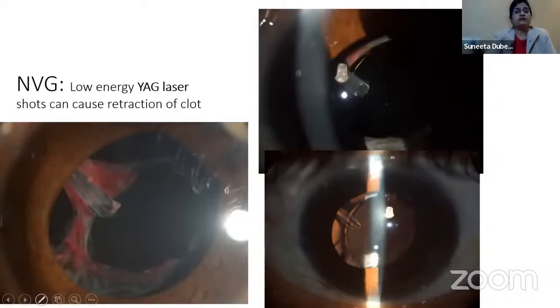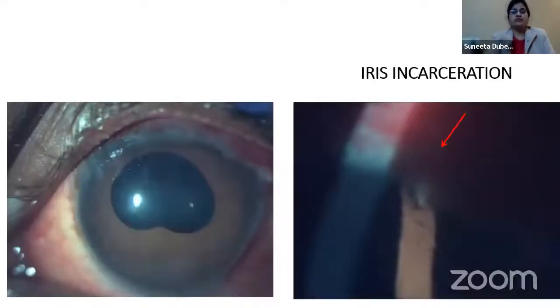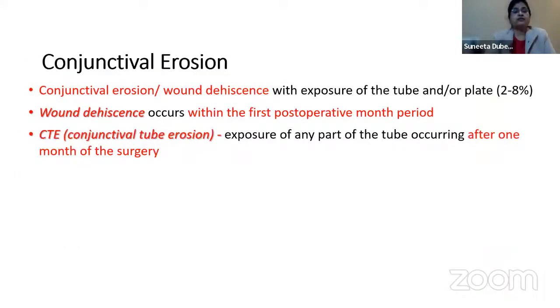So in this particular neovascular glaucoma patient, a low energy laser shot could retract the clot, as you can see, and in another patient too. So most of the time it can be managed with conservative treatment. If the tube is in close proximity to the iris and there is iris incarceration, it too can be managed with a low energy YAG shot, as you can see here. Vitreous, if it is a thin strand, can be cut with a YAG shot. Otherwise, one has to do a vitrectomy.